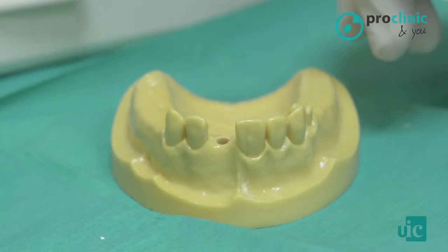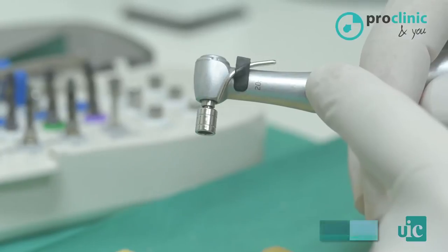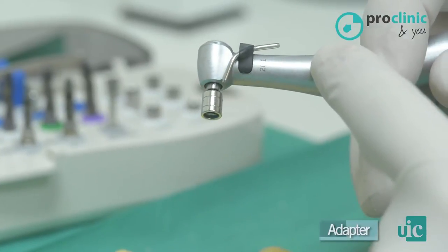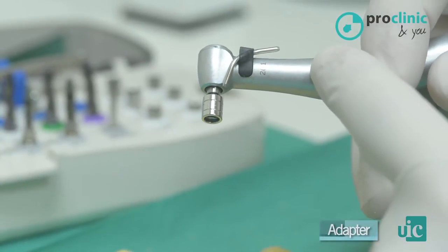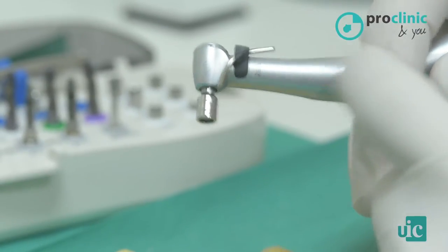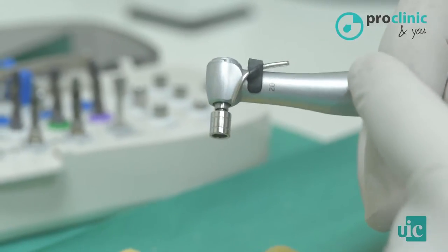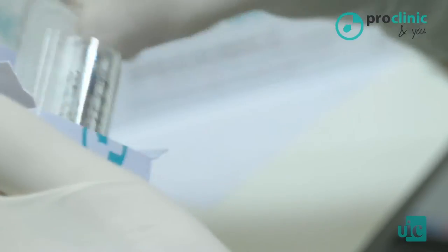Now we are going to proceed with the implant placement. How are we going to place the implant? We are going to place the implant with the help of an implant adapter, like the one that is mounted on the surgical contra-angle, or just manually. In the majority of cases, the implant placement is done with a contra angle, which is much more comfortable from my own point of view.